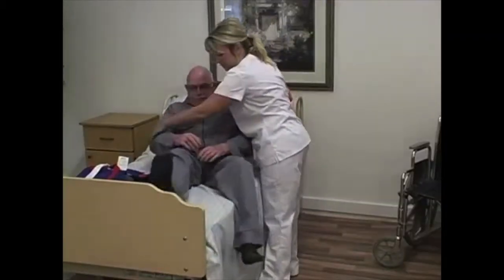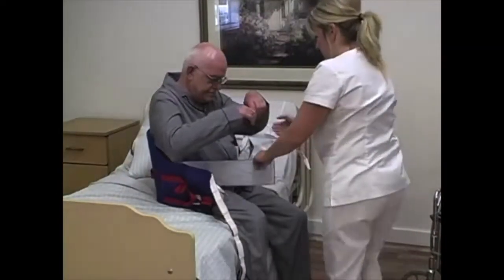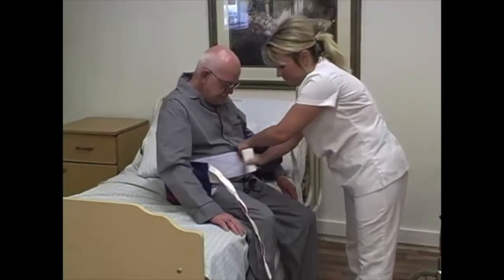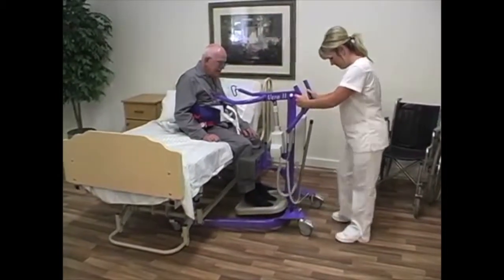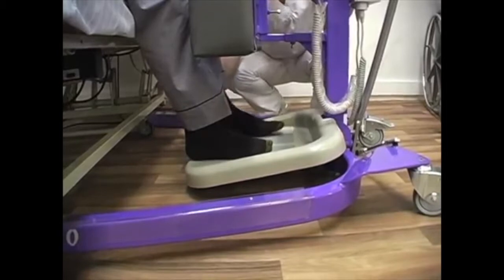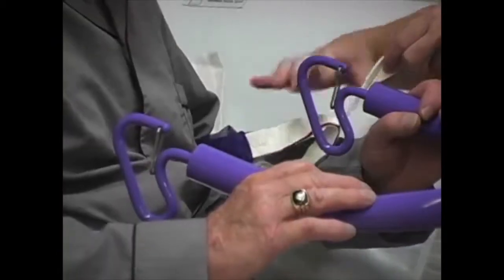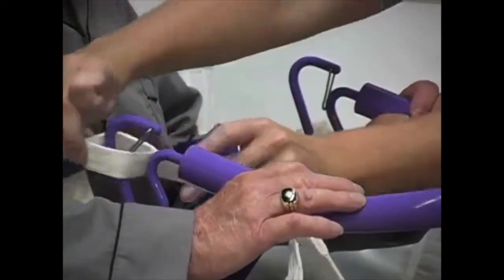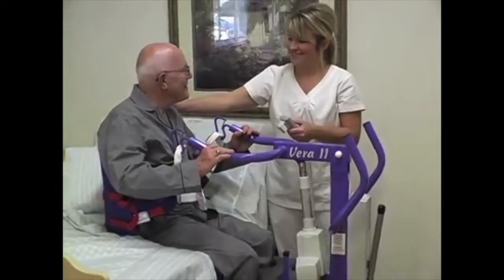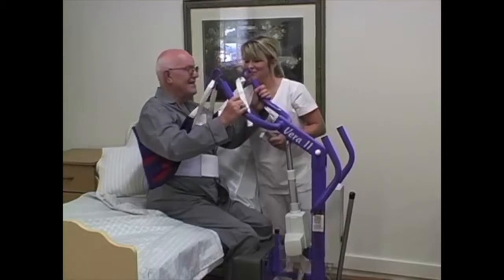Explain the procedure to the client and have the client sit on the side of the bed, helping as needed. Position the back belt behind the client with the client's arms on the outside. Fasten the safety belt snugly. Lower the lift arms and open the base of the lift to its widest position. Move the lift in front of the client and lock the brakes. Have the client place his or her feet flat on the foot pad with knees against the knee pad. Assist the client to hold on to the hand grips or the belt straps. Connect the white loop snugly to the lift arm hooks using the same loop on both sides of the back belt. Double check the back belt loop connection to the lift. Standing next to the client, physically and verbally cue the client to assist in standing. Lift the client to a standing position.